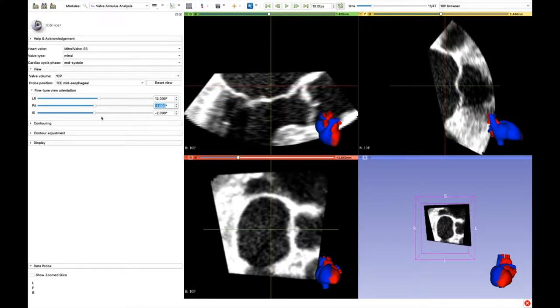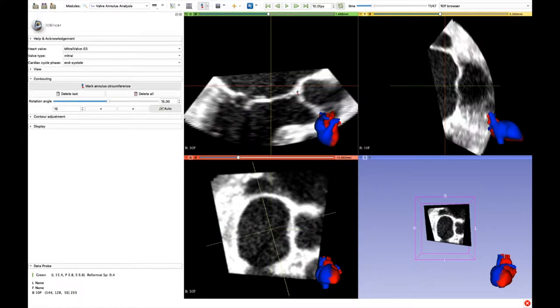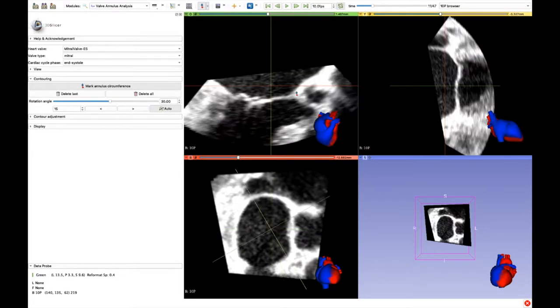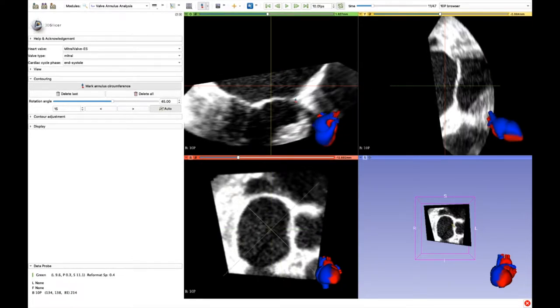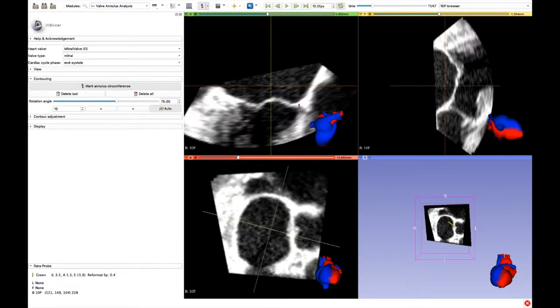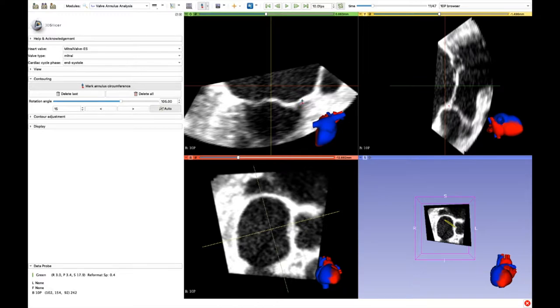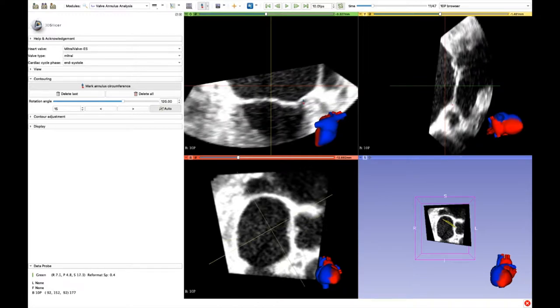Now open the contouring menu, click on Mark Annulus and start placing the 24 reference points starting from the mitral aortic continuity. After each click the next rotational plane will be automatically shown. Remember to place all the marks on the same side of the annulus.